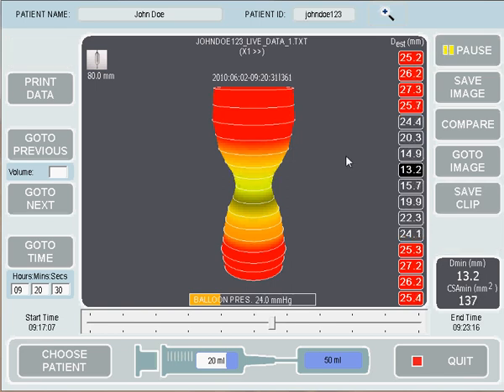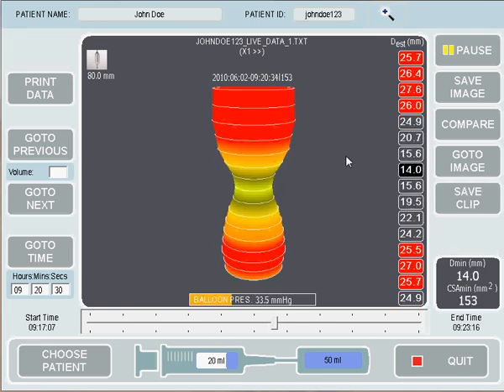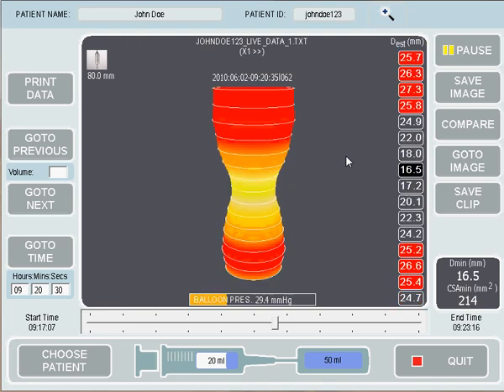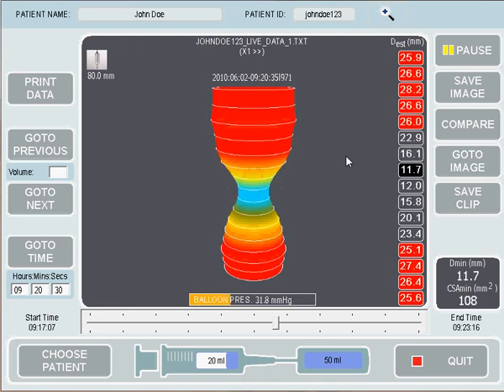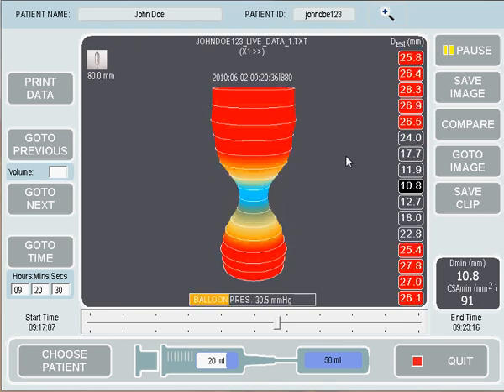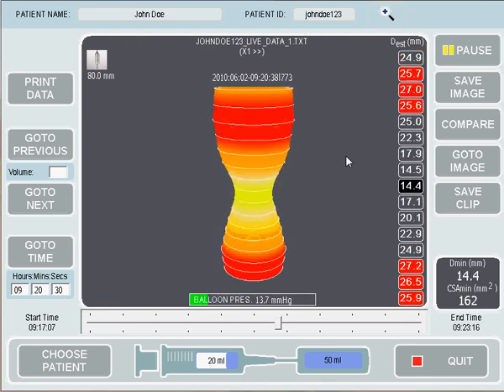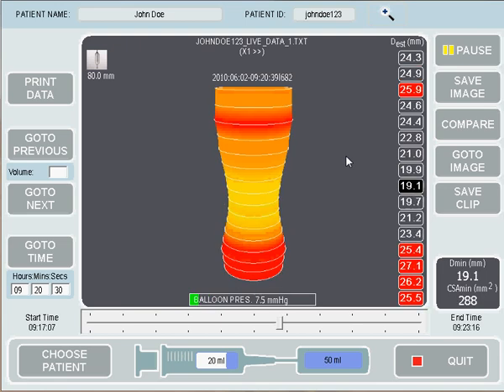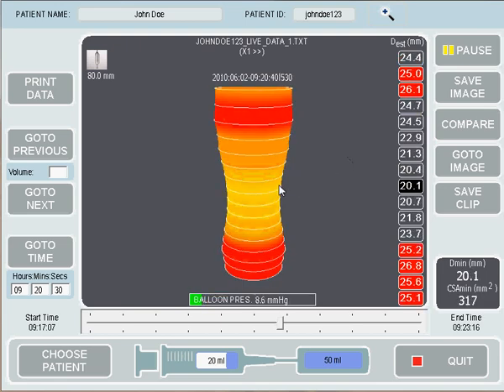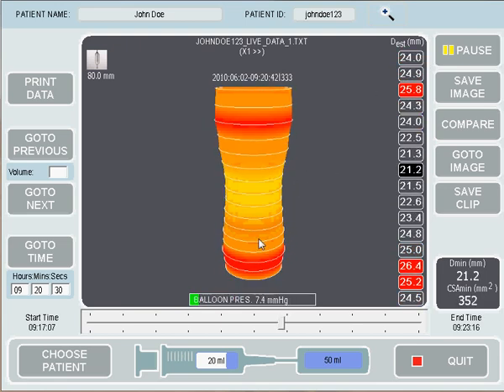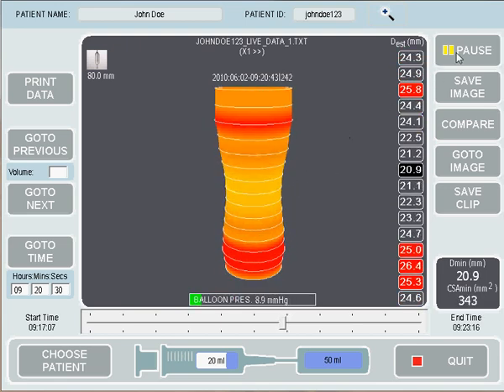You'll see that without filtering, the image actually isn't as smooth as we thought at all. There's quite a lot of movement, as I was simulating coughing by squeezing and letting go of the balloon rapidly, as you can see here. So this is what filtering does to the image.